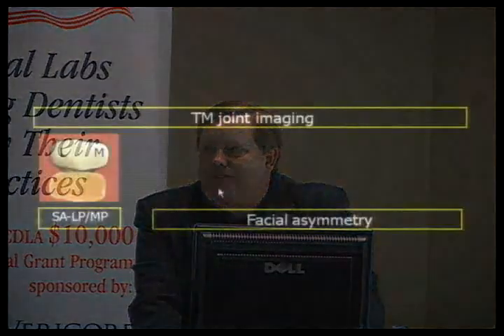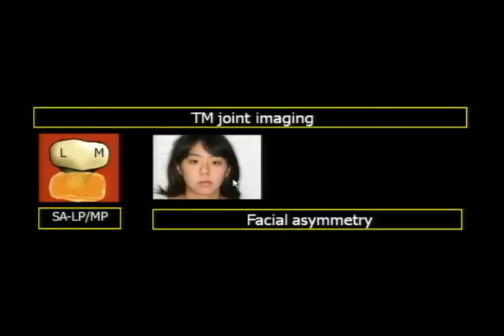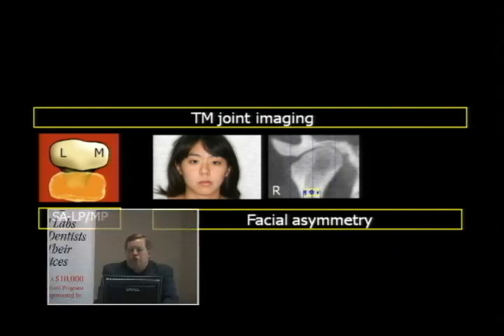And the last is, I have a facial asymmetry, I'm going to image. Take a look at Lori. Pretty obvious where her bad joint is, isn't it? Now when you start to look condyle to chin point, it's her left side. Here's her right side. She's already bone to bone here. This is a cone beam, by the way. That would be different than an MRI.